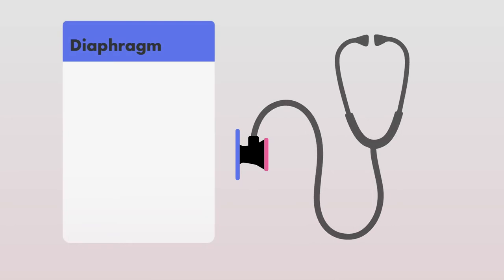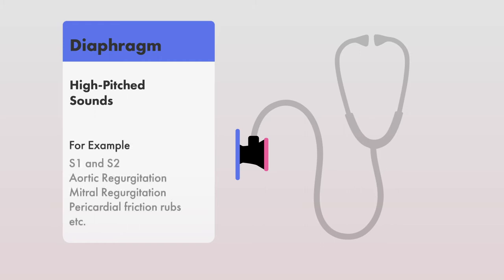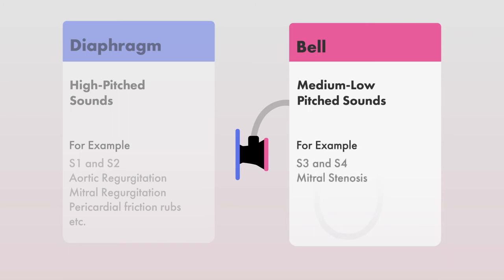The diaphragm is better for picking up high-pitched or high-frequency sounds. Some examples of these are the sounds of S1 and S2, the murmur of aortic regurgitation, the murmur of mitral regurgitation, and a pericardial friction rub. The bell is better for listening to medium to low pitch sounds. Some examples of these are the sounds of S3 and S4, and the murmur heard in mitral stenosis.